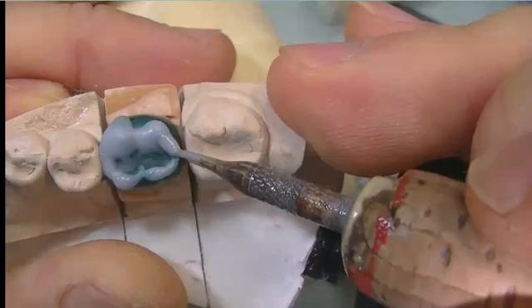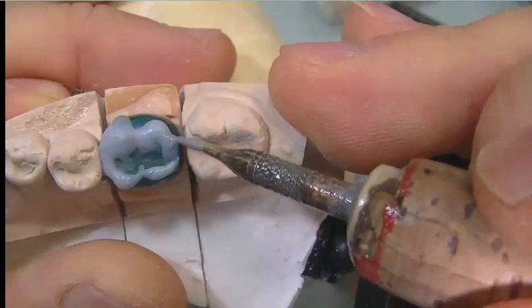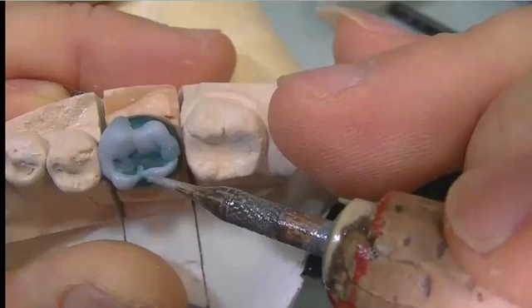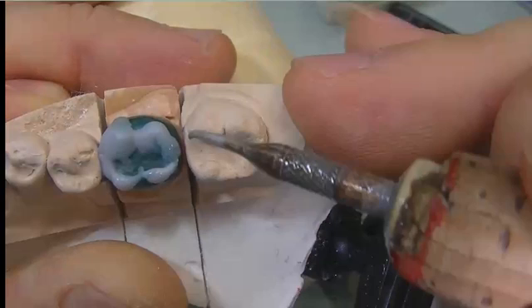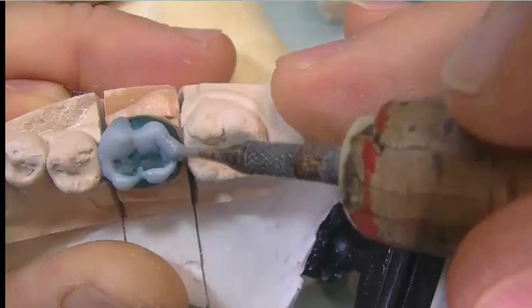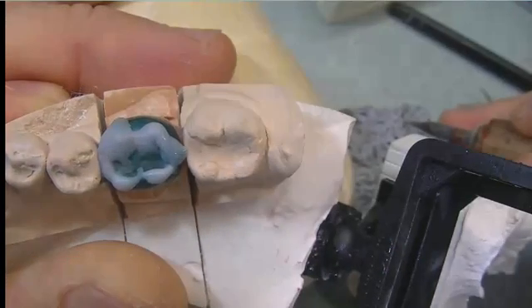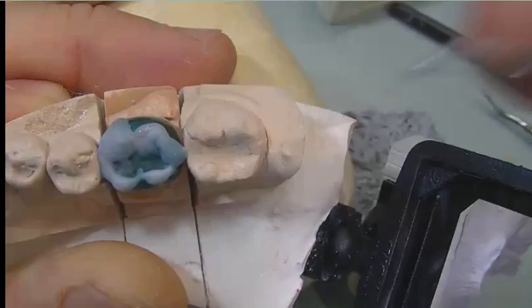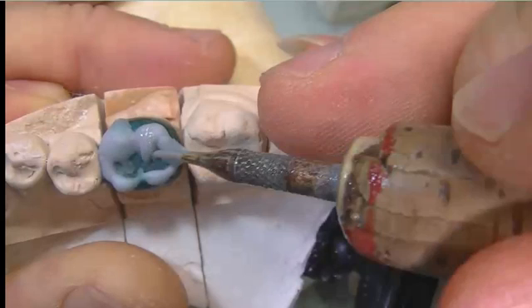While the wax is cooling on the buccal side, we add some new wax around the margin, moving around by adding a minimal increment. We also add wax on the distal buccal cusp, which is a small cusp.